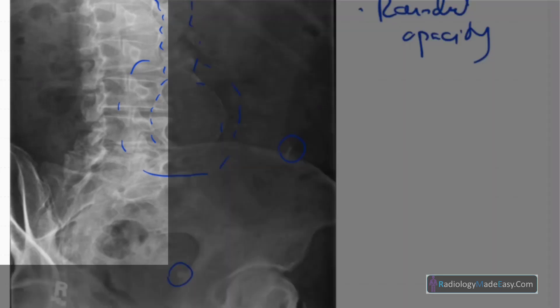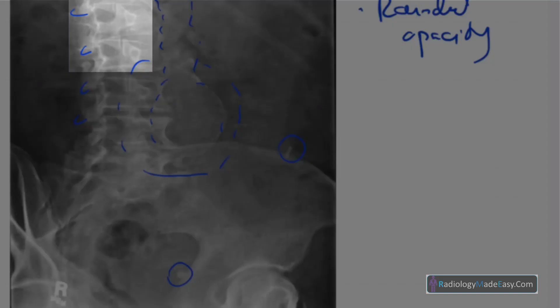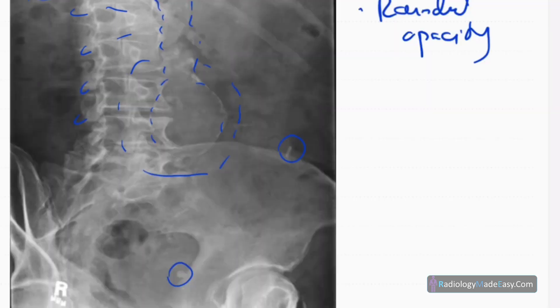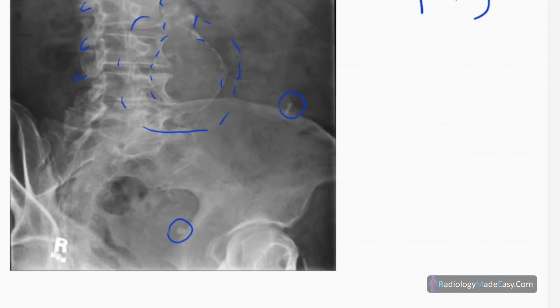There are also some degenerative changes here — osteophyte formation with reduction in intervertebral spaces, and probably some wedge fractures due to osteopenia or osteoporotic fractures. There are also costovertebral junction calcifications.